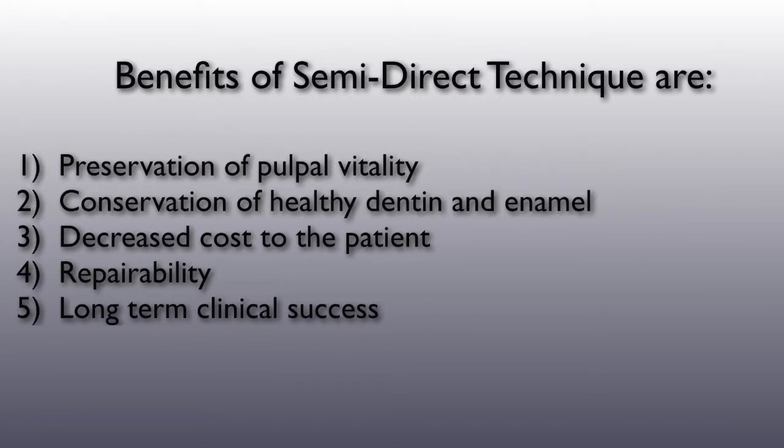There are many benefits of restoring a tooth with a semi-direct technique. They include preservation of the pulp vitality, conservation of the healthy dentin and enamel, a decreased cost to the patient, a restoration that's repairable, and a long-term clinical success can be expected.